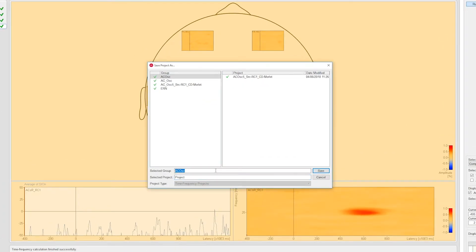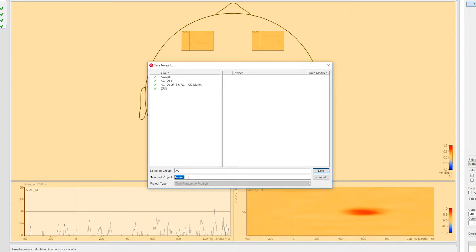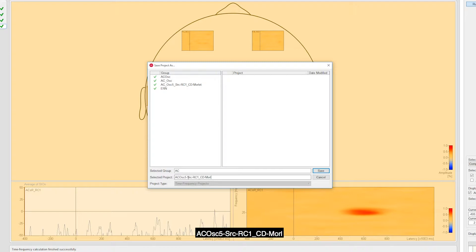We can finish the workflow now and save the project. I would recommend putting different experiments into different groups and including the montage name in the file name. So here I will call it ACOSC5SRCRC1CDMorley. Then I have the original file name, montage, and method names covered.